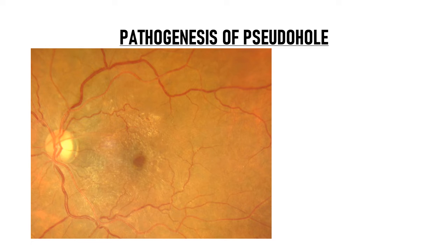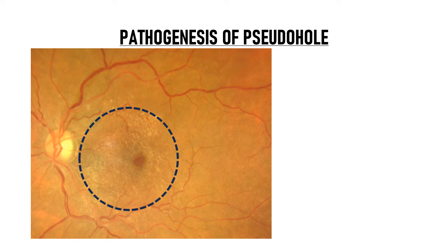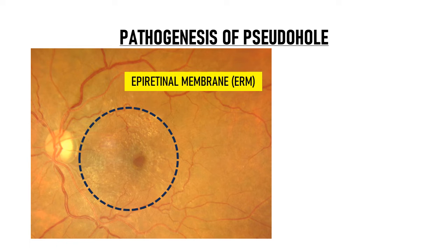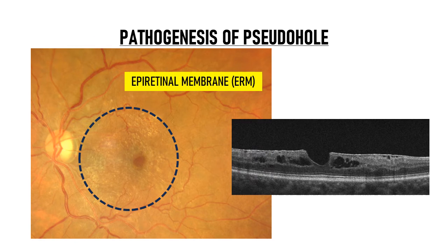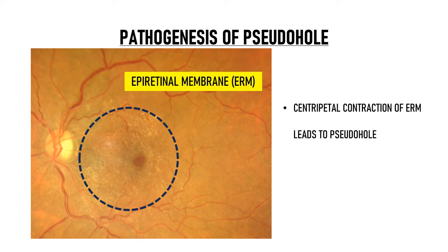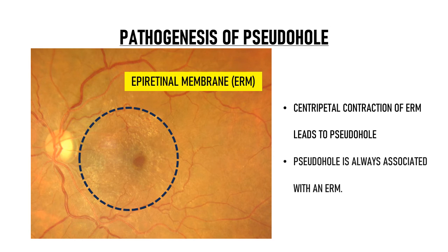So why exactly does a macular pseudo hole develop? If you see this image again, you will see a shiny membrane-like reflex surrounding the fovea. This is an epiretinal membrane, or ERM. On the OCT, this ERM appears as a hyperreflective line covering the internal limiting membrane. This line here is the ERM. Centripetal contraction of ERM leads to the development of a pseudo hole. Thus as a rule, a pseudo hole is always associated with an ERM.